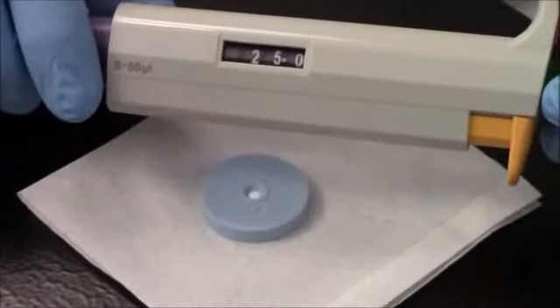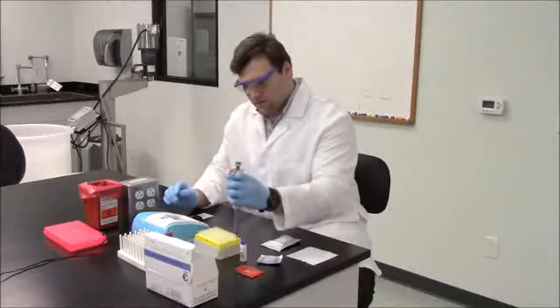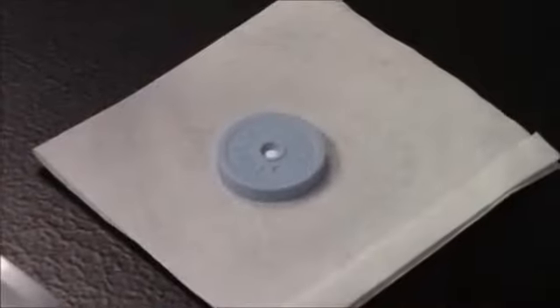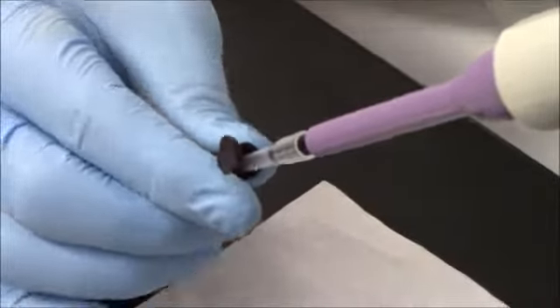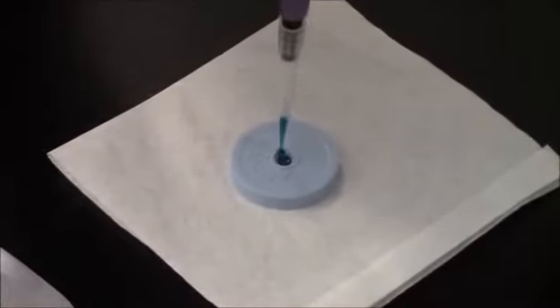To load the disc, ensure that your pipette is set to 25 microliters. This is when you depress the plunger fully to draw up more than 25 microliters of sample. Then, only dispense 25 microliters of sample onto the disc by depressing the plunger to the first stop.